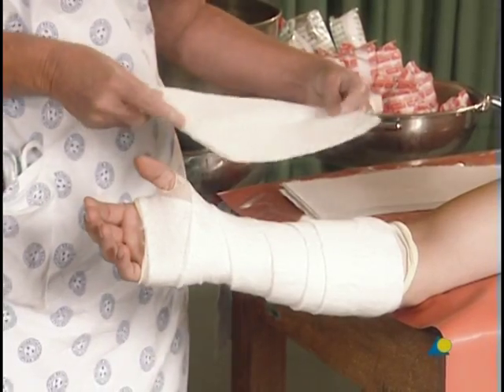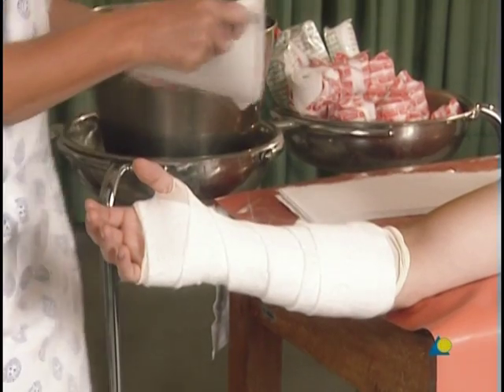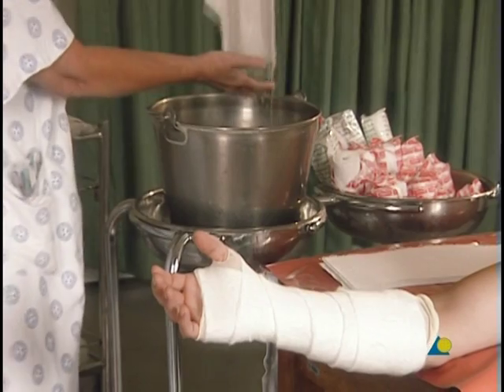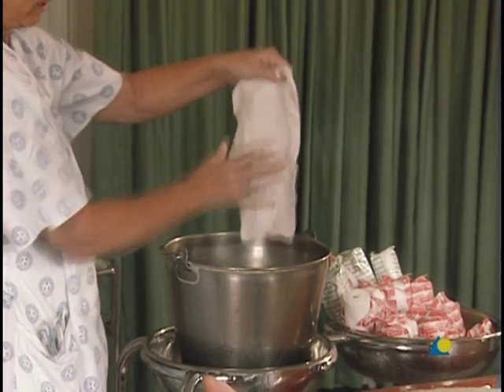The slab is cut to length with a space for the thumb. The slab is wetted by pulling it through the water. The excess water is removed by squeezing it slightly. The slab is then applied.